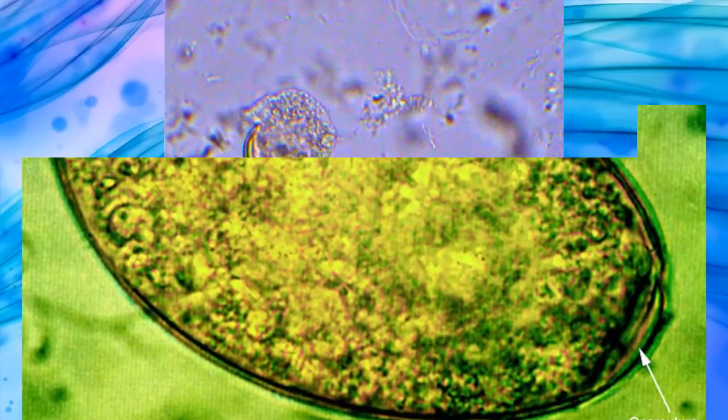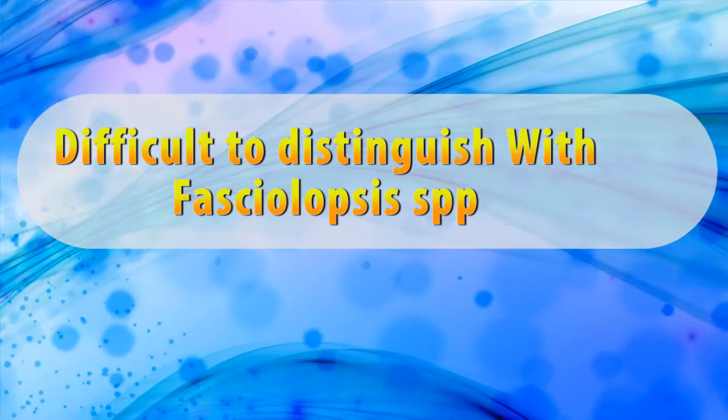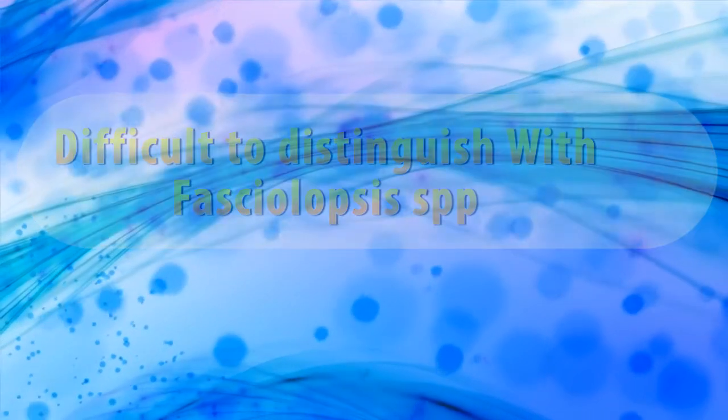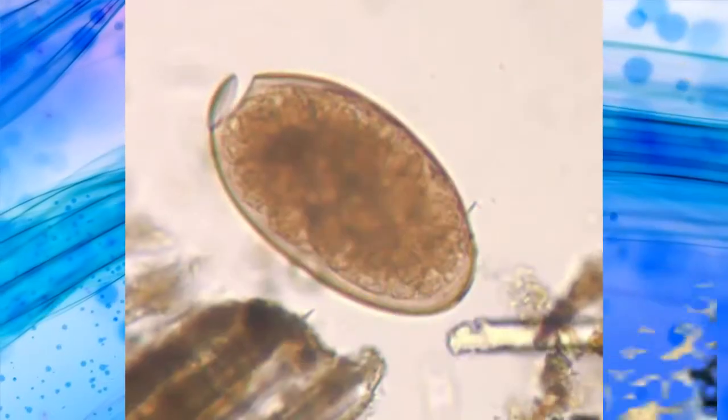Only small numbers of eggs are found in the stools. The eggs of Fasciola hepatica can be difficult to distinguish from Fasciolopsis species, although the abopercular end of the former often has a roughened or irregular area.